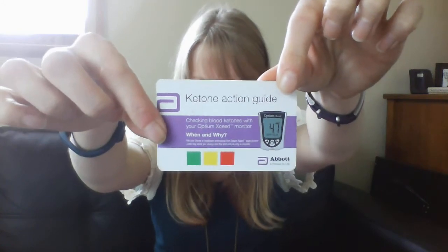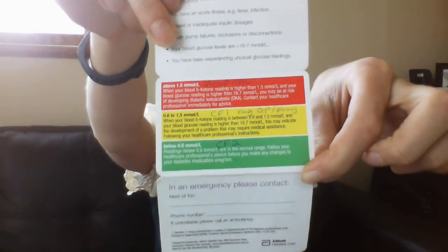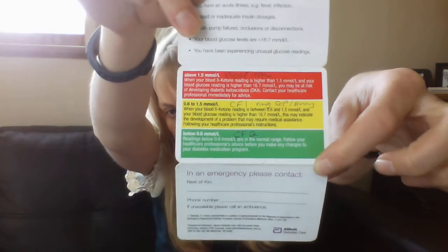These don't come with your ketone strips, but you can request one from your endocrinologist or diabetes facilitator. What it has is this handy dandy little shaded chart. That tells you, when you test for your ketones, what level they are, if it's okay, if you need to be ringing your endocrinologist, or if you need to go to the emergency department. So always keep that on hand, because I always forget what numbers your ketones should be. I know that 0 is good, but beyond that I don't know when I need to be looking for help.